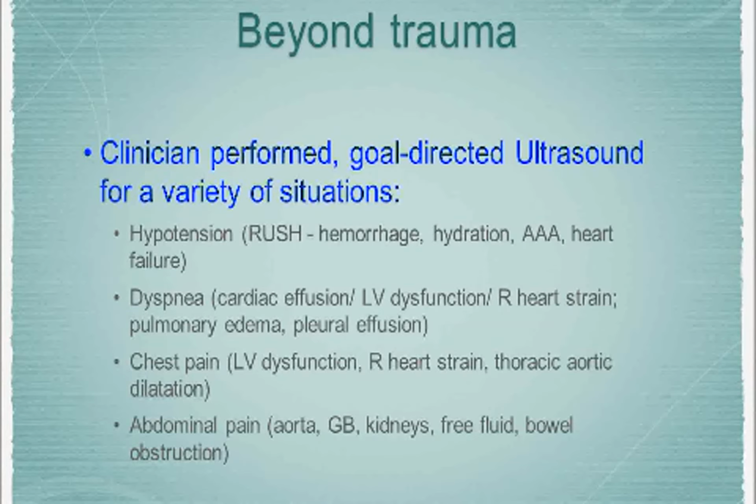I diagnosed an in-progress myocardial infarction that wasn't a STEMI yet in triage. The EKG didn't meet STEMI criteria. Guy was having chest pain. We get a lot of those. I took the ultrasound machine to triage, and he had a focal wall motion abnormality. And I called the cath lab from triage, even though there wasn't a STEMI. He STEMI'd like 10 minutes later.